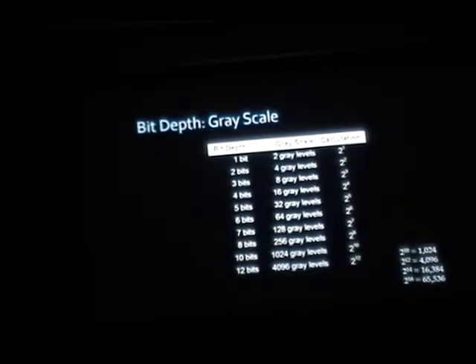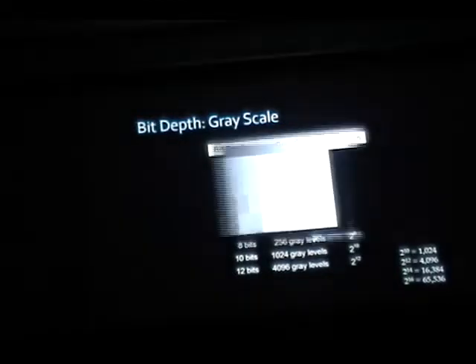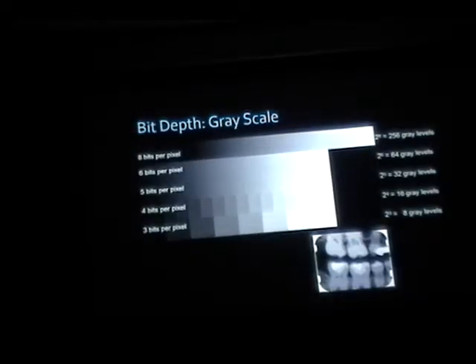And this is what we are using at our demo school, 2 to the power of 16, that is 65,000 colors will be displayed. So it takes a little more time to pop up on the screen because it has to process so many colors. So if you have more bits, that means you will get a better picture.